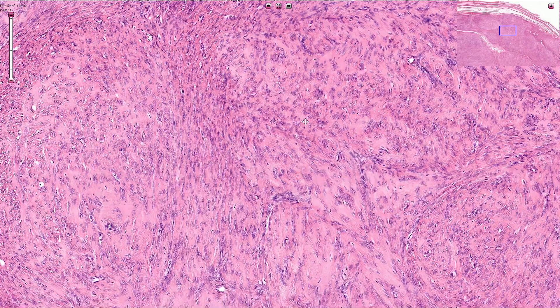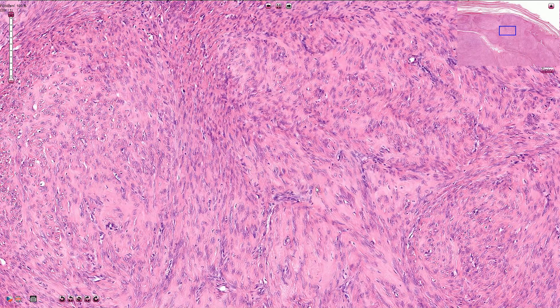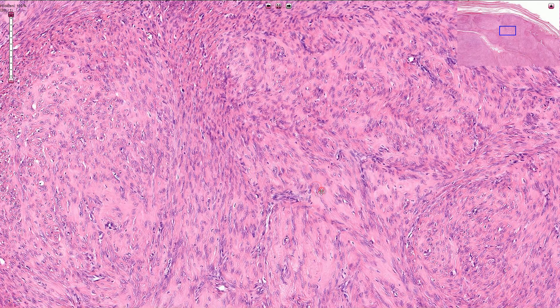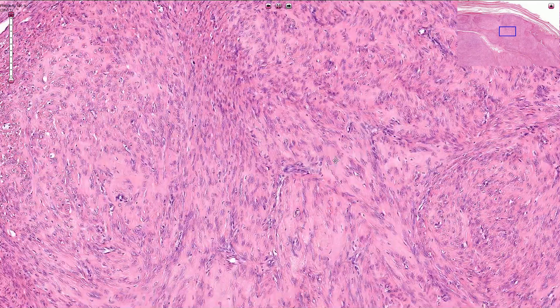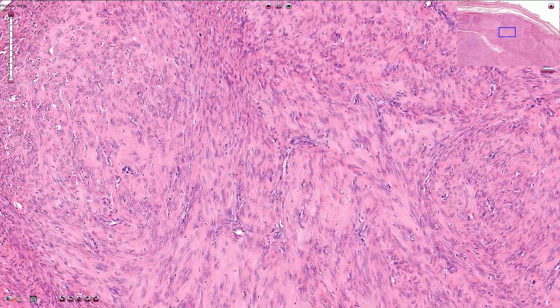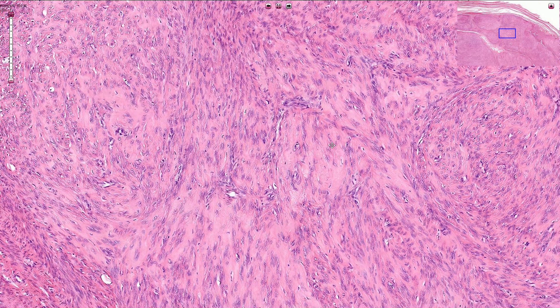These nuclei typically have blunt ends and are sometimes compared to cigar-shaped structures — so cigar-shaped nuclei of the smooth muscle cells. This is quite a useful sign and it helps us to differentiate leiomyomas from neural tumors, which typically have pointed nuclei.